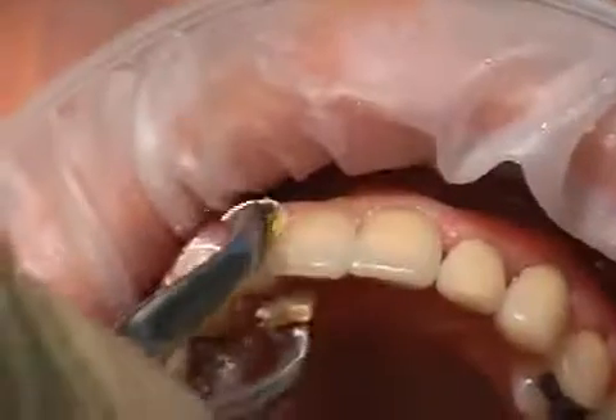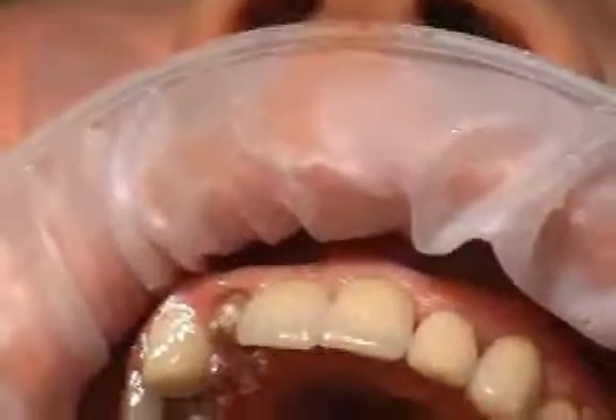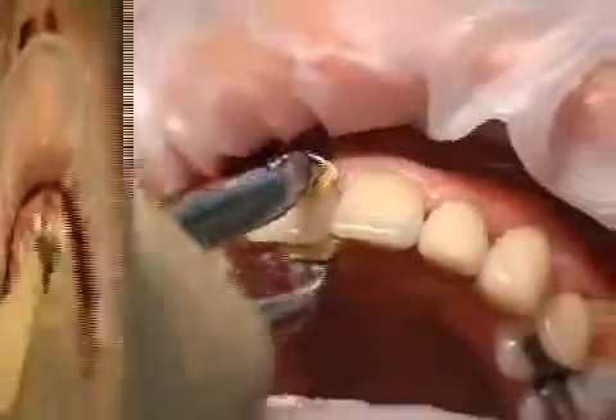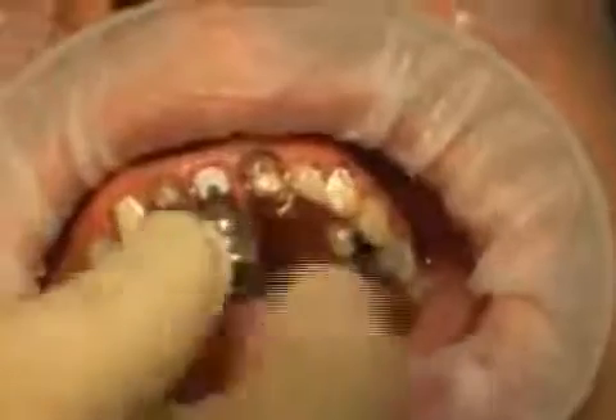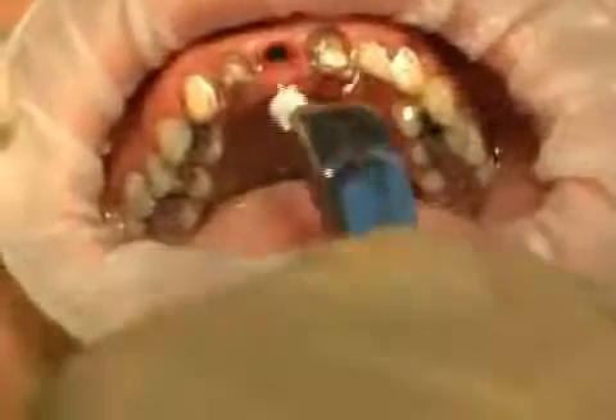In the film you will now see how provisionally cemented crowns are removed from the tooth stumps. One of the crowns being removed is an implanted crown held in place by a zirconium abutment. The abutment's fixation screw is loosened and the abutment is subsequently removed.